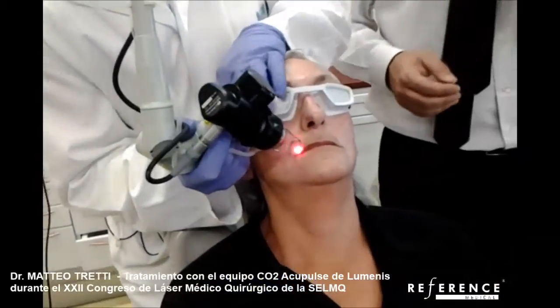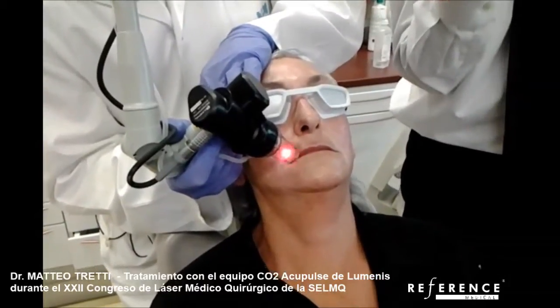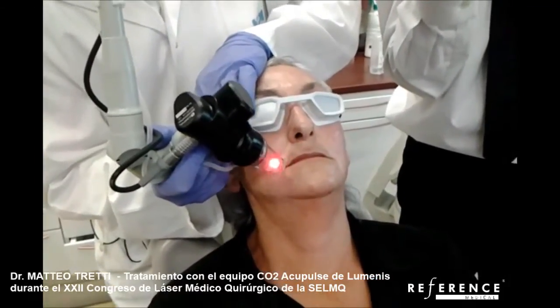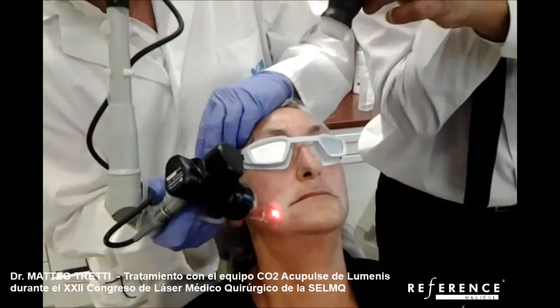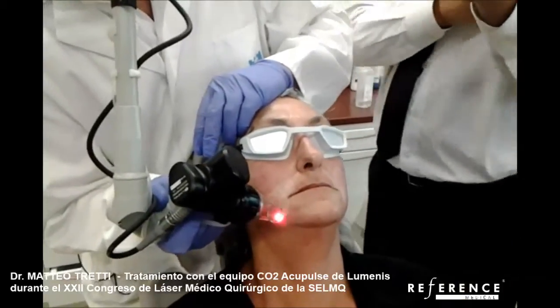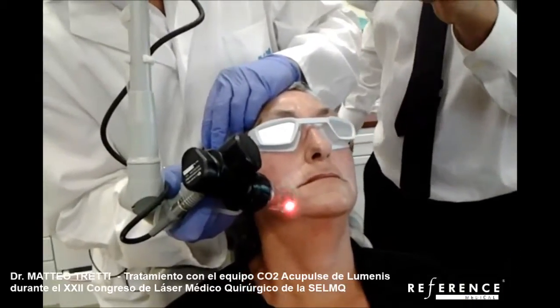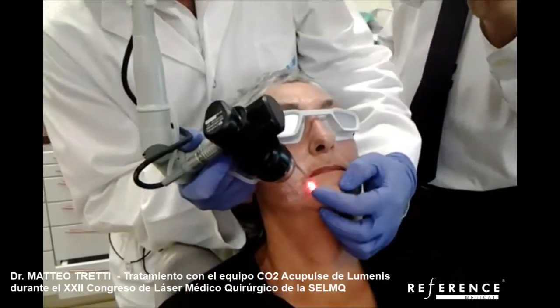I will use 12.5 mJ and 5% coverage for the deep, and 80 mJ for the superficial. We applied the anesthetic cream one hour before the treatment, and the patient started to take antiviral drugs yesterday.